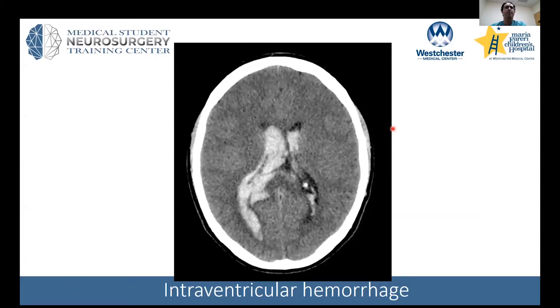This is a different type of bleeding pattern — intraventricular hemorrhage. Here we see the ventricles, which should be nice and dark, are actually bright and filled with blood.